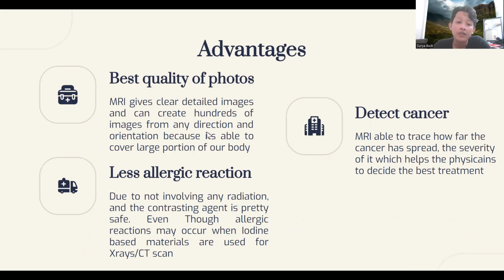Then MRI causes fewer allergic reactions in the patient's body because it does not involve any radiation, and the contrast agent is pretty safe, even though an allergic reaction may happen when iodine-based material is used for the X-ray or the CT scan.